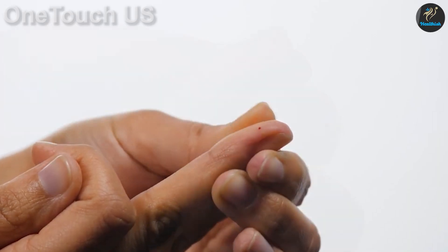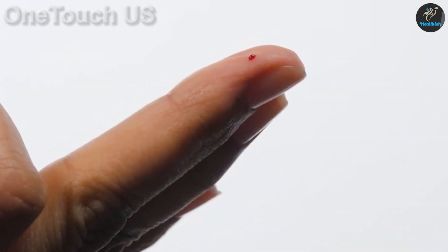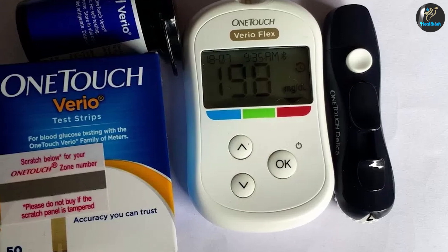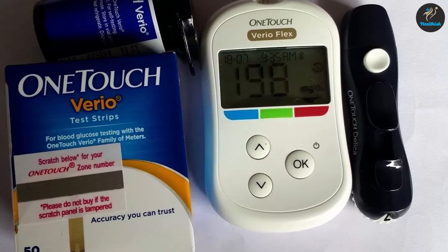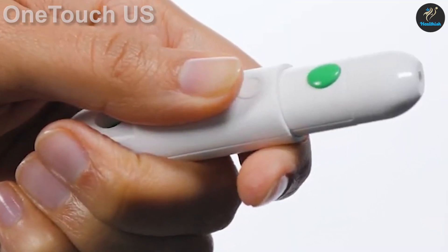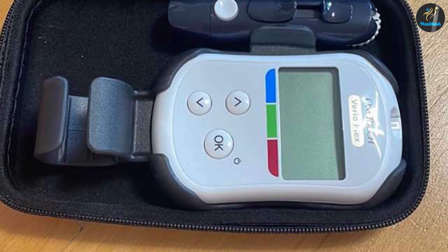The One Touch Vireo Flex is simply designed for a minimal look — mainly screen with a small three-button control system. What's really appealing is the color-coded results, which lets you get an at-a-glance reading even if you're not seeing clearly at the time. You still get your exact number, but this is just a nice addition. If this isn't enough, you should consider the Prodigy Voice, which actually reads out your results to you.